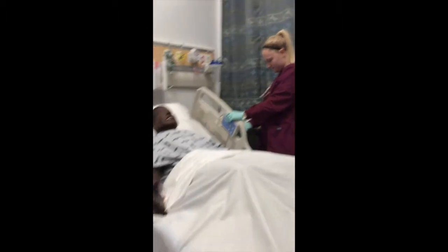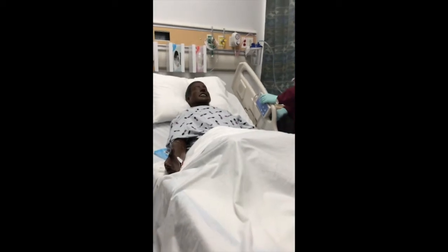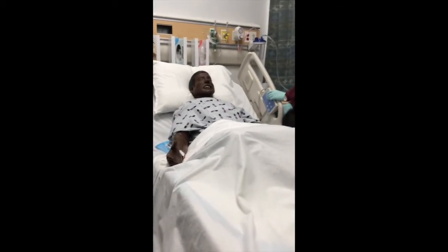Still working right. Okay. Oh, yeah. Okay. Yeah.